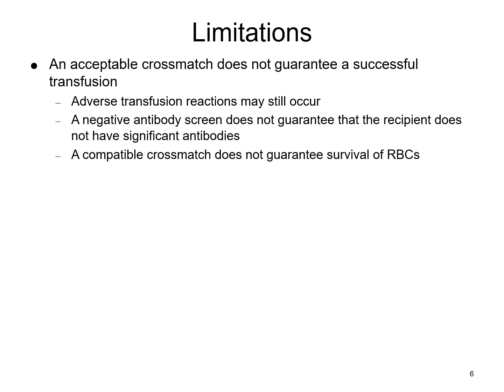And a compatible cross-match does not guarantee the survival of the red blood cells. So just because you get compatibility on your cross-matches does not mean that once they enter that patient's body, the patient will not have a response and then ultimately end up destroying those red blood cells. So there are still some limitations. You do everything you can to try to provide that safe product, but there are still things that can happen that are beyond your control.